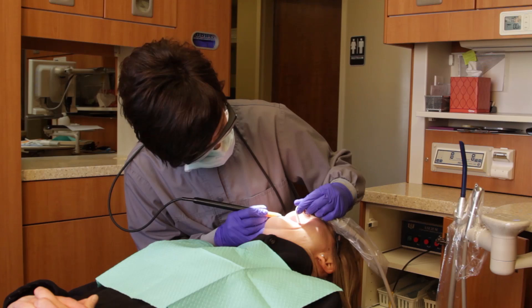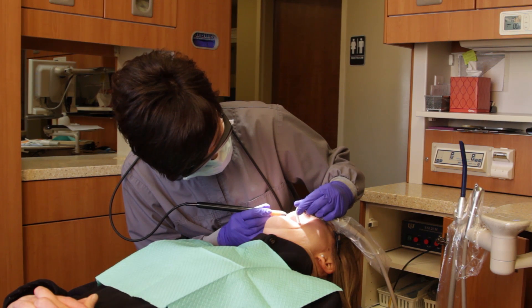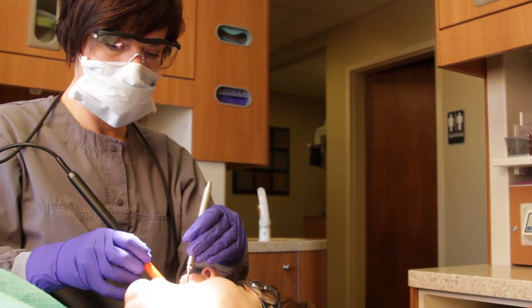Without the hands-free suctioning the BlueBoa provides, a clinician would have to compromise their posture to see this area. But with the mirror and BlueBoa, there is excellent indirect vision, allowing the clinician to sit up straight.